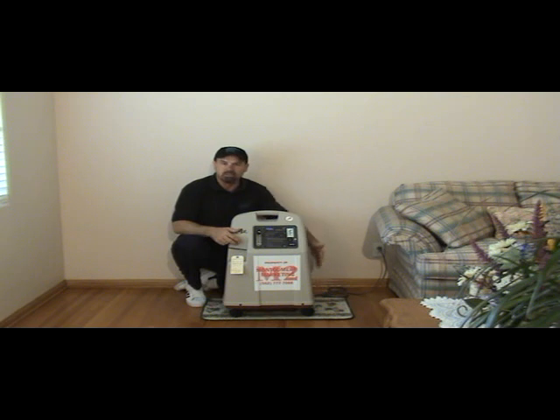It's not up against any drapes or linens that can go against the filters and occlude them and cause the unit to run much hotter. There's nothing around here that's a heat source like a fireplace or something like that that can also add to the unit heating up and running less efficiently. So this is a good area right here to set it up.